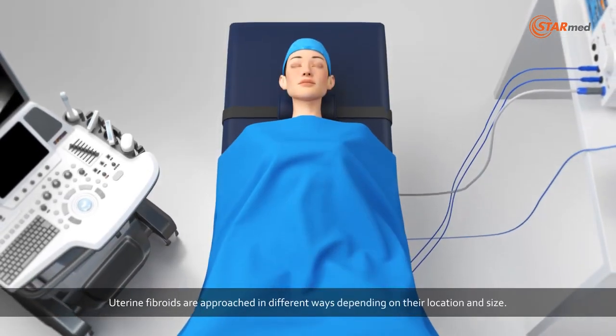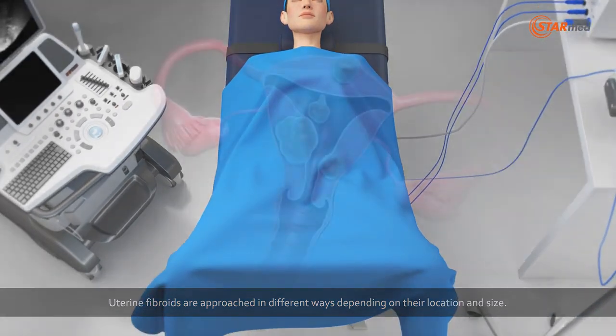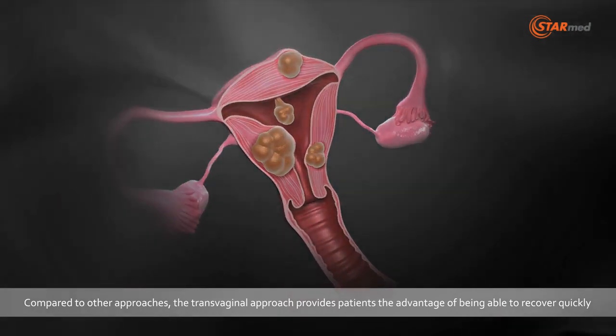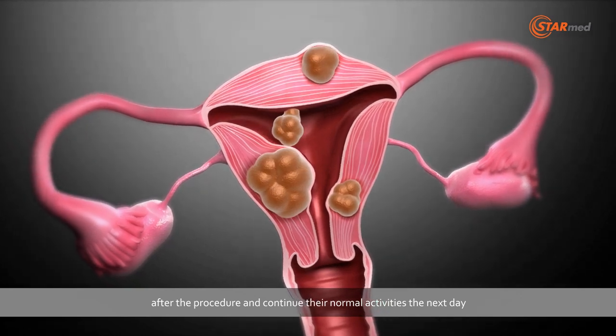Uterine fibroids are approached in different ways depending on their location and size. Compared to other approaches, the transvaginal approach provides patients the advantage of being able to recover quickly after the procedure and continue their normal activities the next day.